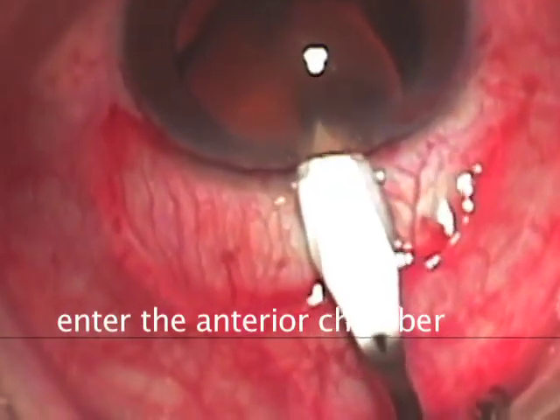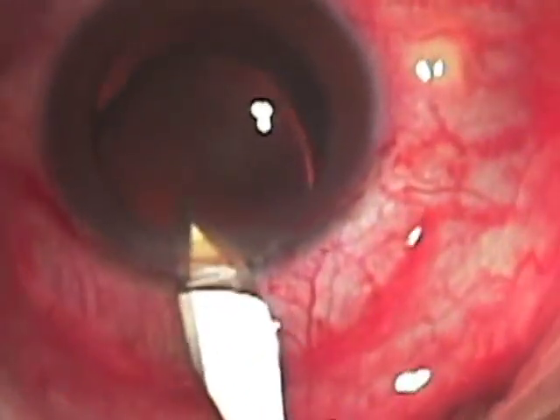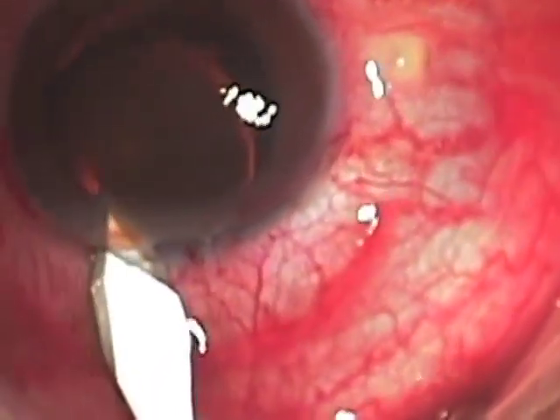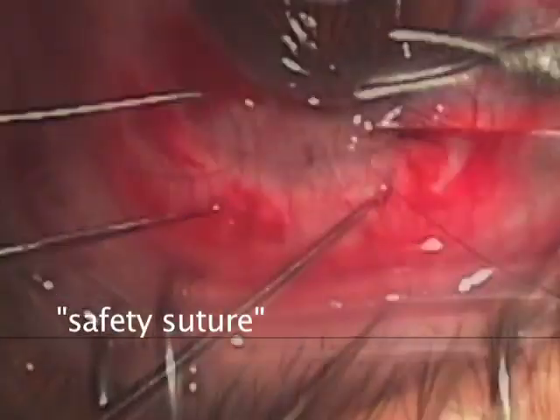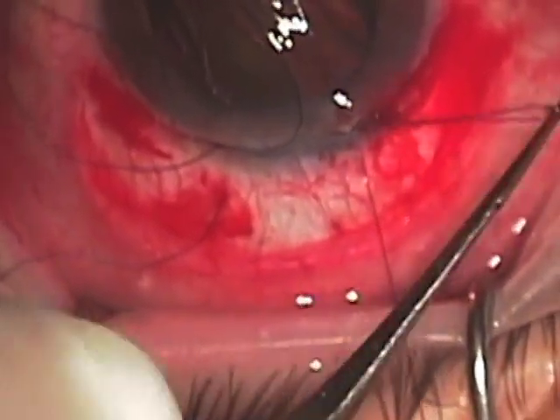This wound with the keratome or other instrument is then extended left and right to allow just enough access that we can place our two safety sutures before opening the rest of the incision. Our safety sutures are 9-0 nylon and are looped so that the suture won't be in the way of the next step when we want to remove the lens.